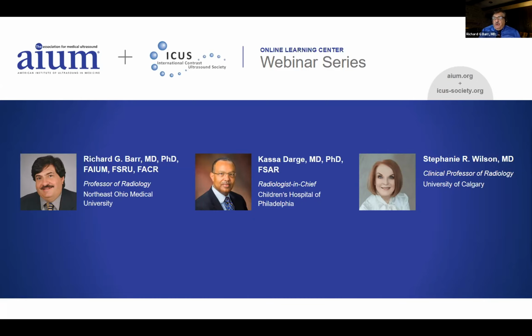So preliminary work on a relatively small number of patients suggests that using time intensity curves, we could evaluate renal carcinomas and select out which are going to have a favorable outcome with just watching versus those that need more immediate treatment because they're more likely to metastasize. So I will add that there.